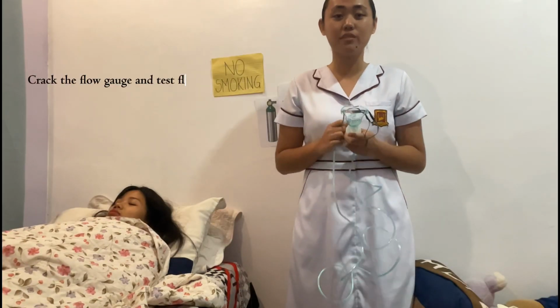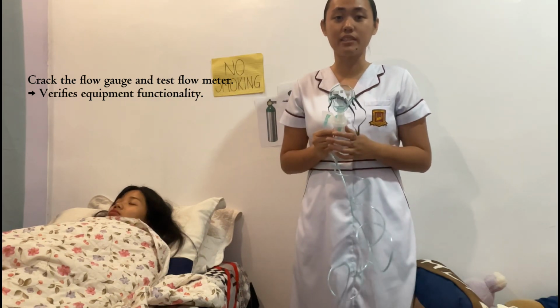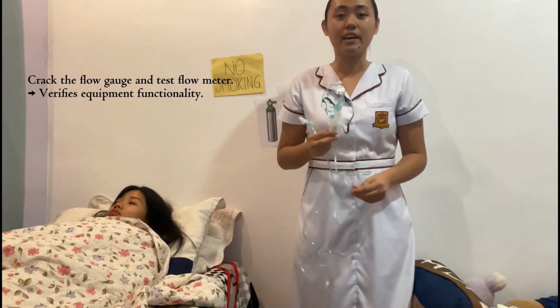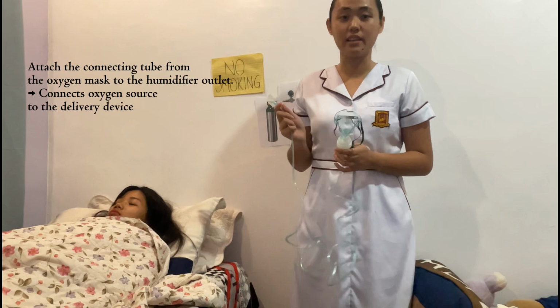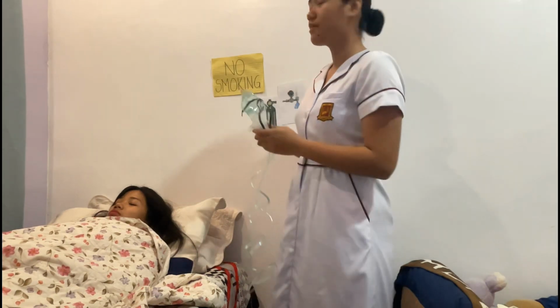So now crack the flow gauge and test the flow meter. So this verifies equipment functionality. And then attach the connecting tube from the oxygen mask to the humidifier outlet. So this connects the oxygen source to the delivery device.